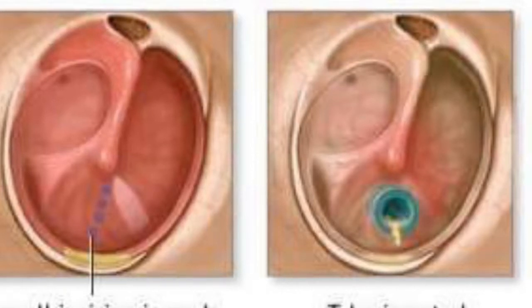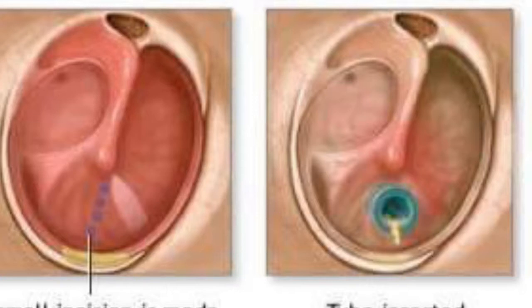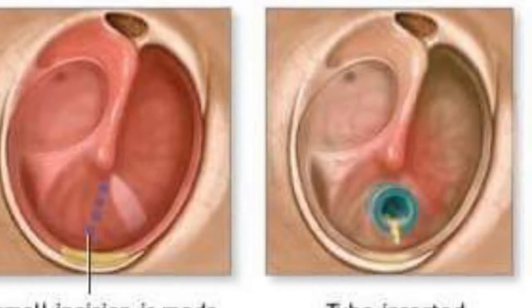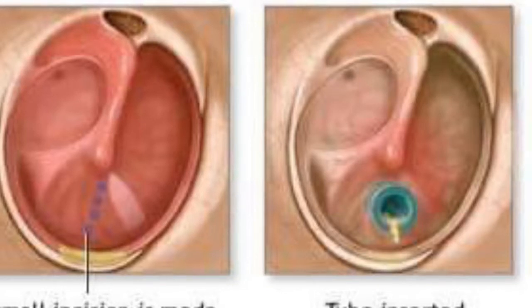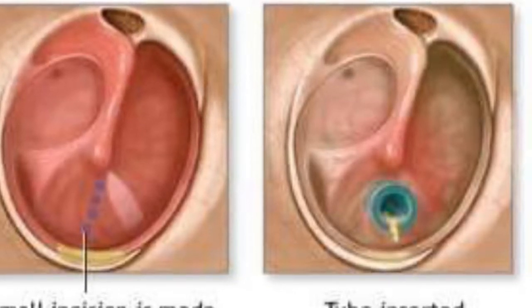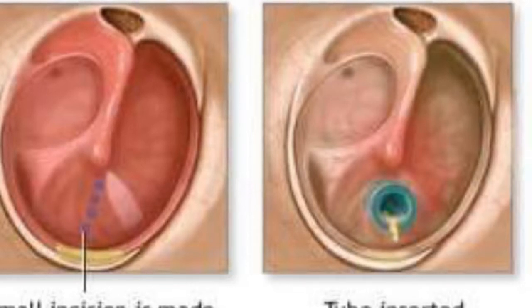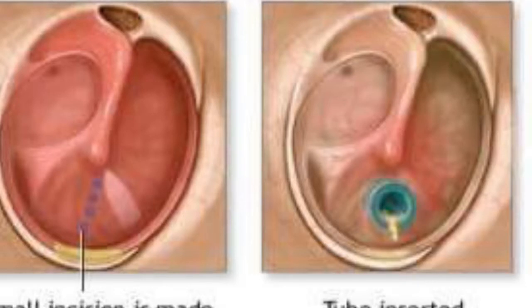If microscopic examination is used, it is performed with a 250 mm lens and ear speculum. CT and MRI are used for abnormalities like asymmetrical hearing loss, nasopharynx mass, oropharynx, ear, or cholesteatoma or infection are suspected.